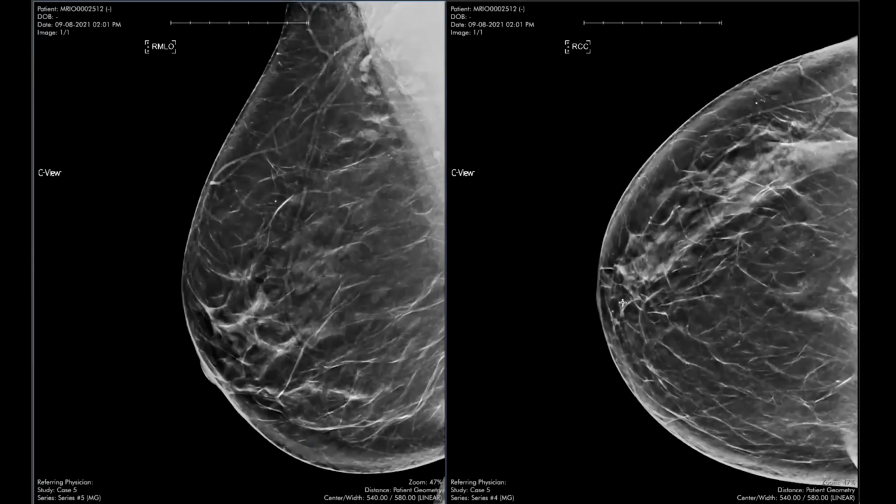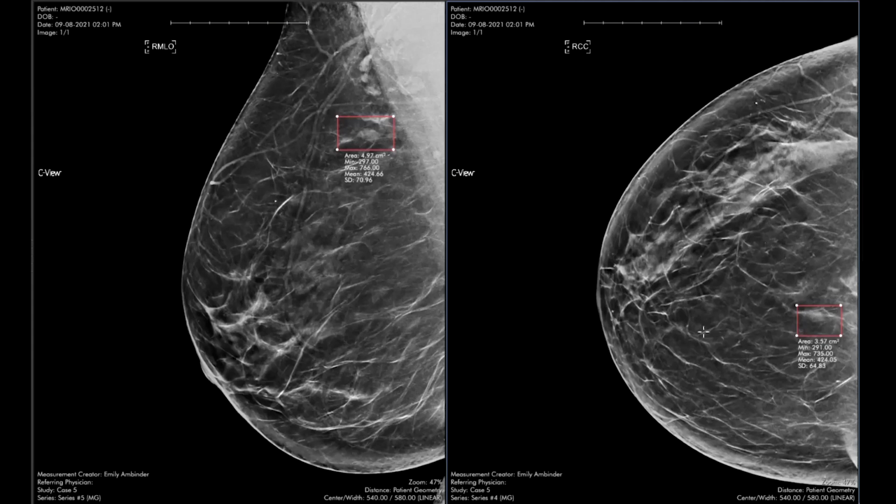Okay, so this is another companion case and also a good case to transition to our next section. This is another baseline screening mammogram. And this patient has an oval circumscribed mass in the upper outer right breast, which we see here. Again, like the last few cases, this was given a BI-RADS 0. She came back for additional mammographic images, and those are usually the spot compression images. This finding persisted on the spot compression images, and so we did a targeted ultrasound.